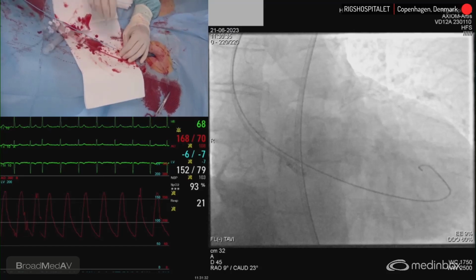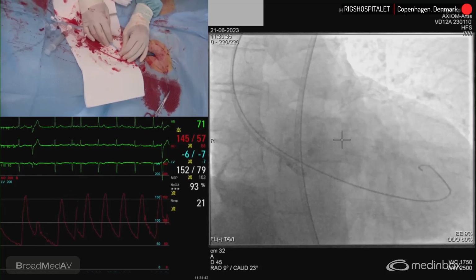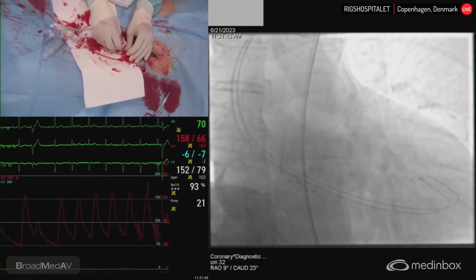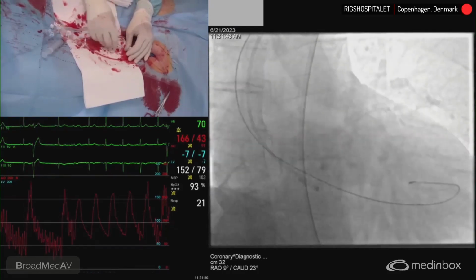98% of cases good, but you take a little more risk. It's more aggressive to come out with a stiff wire. You can have more perforation. It also gives you better possibility to do proper hemodynamics with the pigtail. So we like to change it to the pigtail just to assure you're out of the mitral chordae to do a proper hemodynamics measurement.